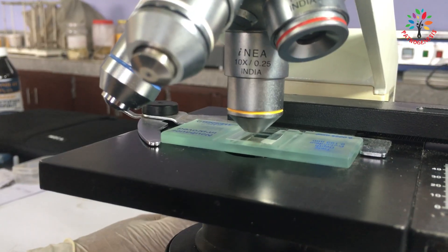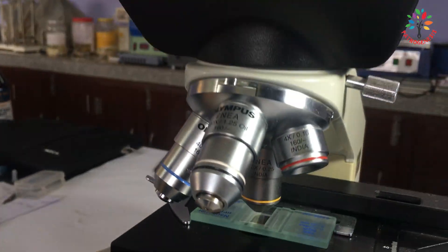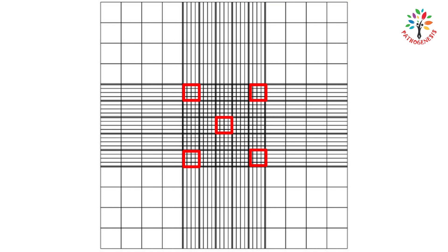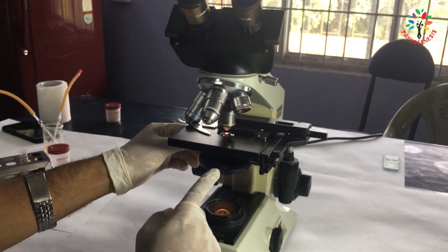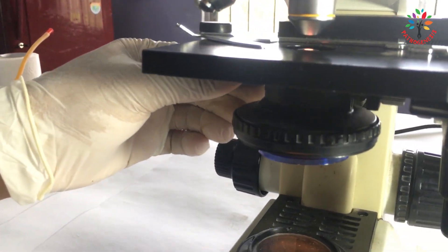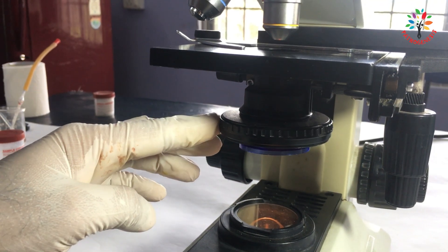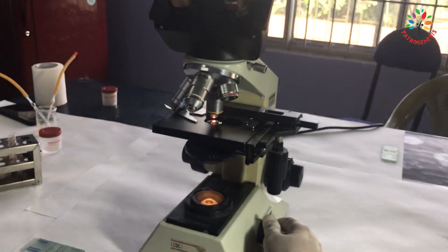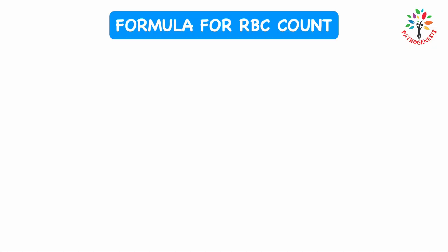Focus under the microscope and count the RBCs in the 5 small squares within the central large square. The 5 small squares are highlighted in red for clarity. While focusing the Nuber's Chamber under the microscope, keep the condenser lens down and the diaphragm slightly open with low illumination to reduce the light — otherwise the lines of the Nuber's Chamber will not be visible.